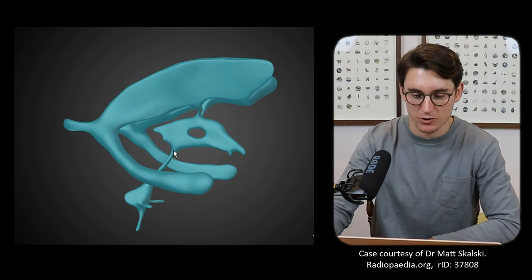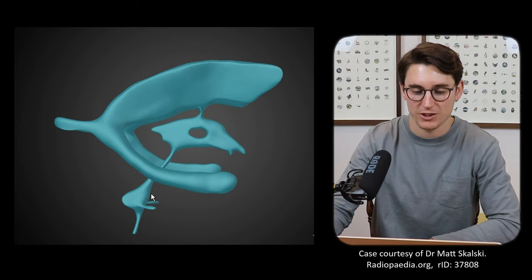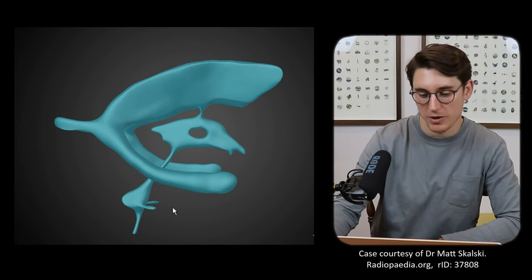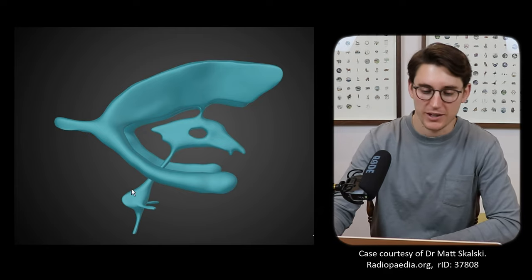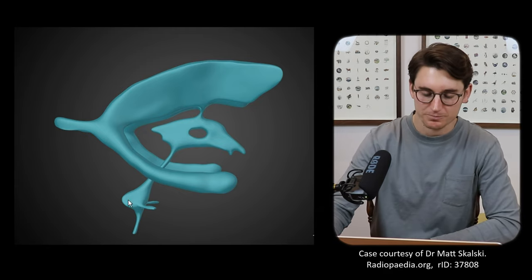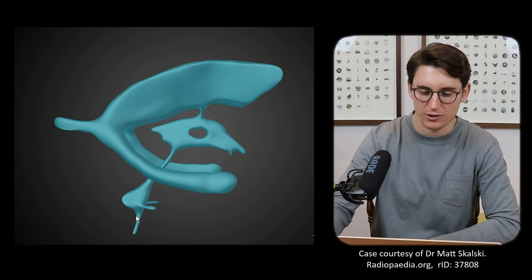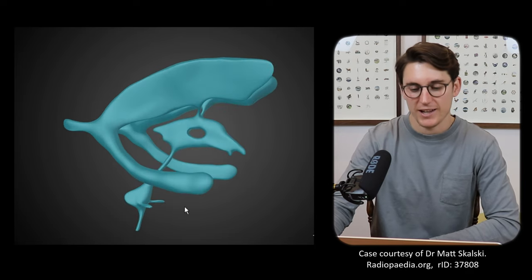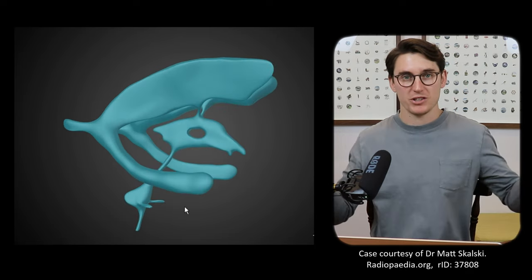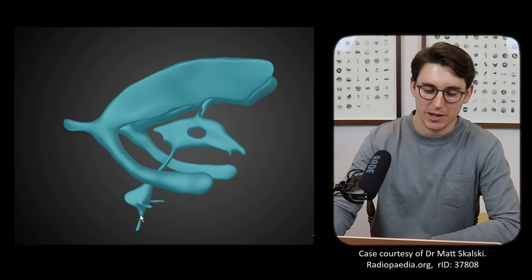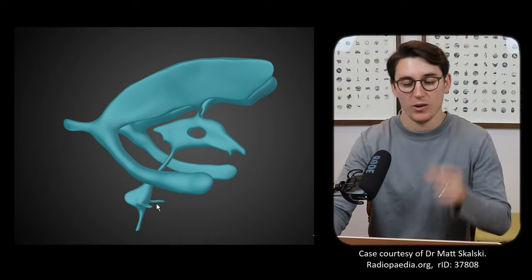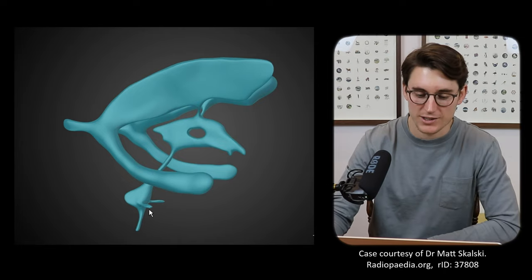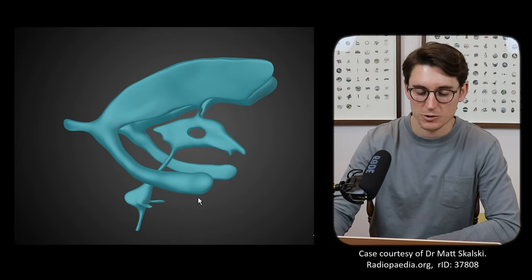Our third ventricle feeds down through the midbrain into our fourth ventricle. Our fourth ventricle is bordered anteriorly by the pons and posteriorly by the cerebellum, making this classic triangle or diamond shape. Then we have these lateral apertures as well as this median aperture, and then we have a connection with our central canal of our spinal column.